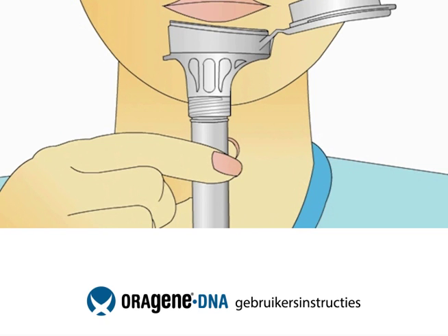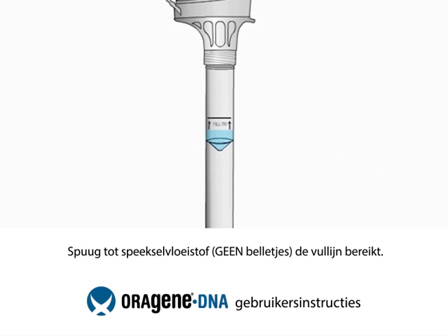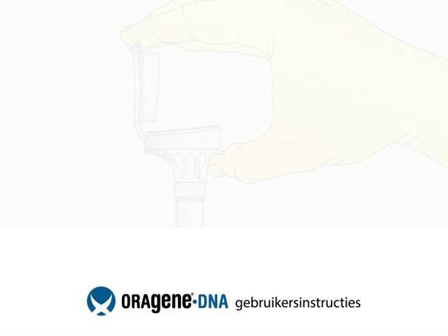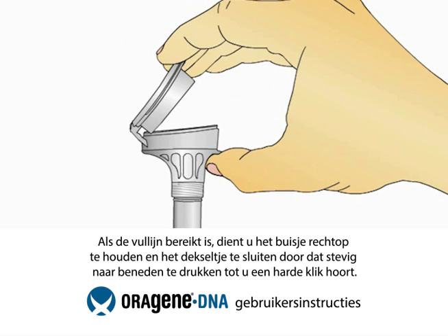Some people will have bubbles or foam in their saliva. Be sure that you spit enough liquid saliva, not including bubbles, to reach the fill line. You will find the fill line on the label on the side of the tube. Once your saliva reaches the fill line, close the lid by firmly pushing the lid until you hear a loud click.